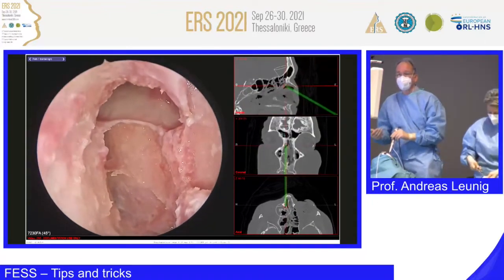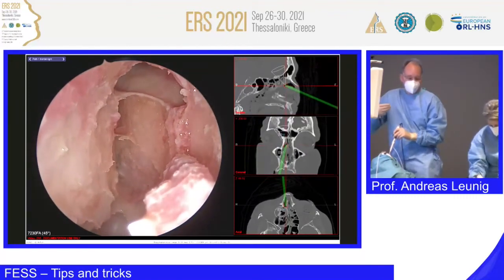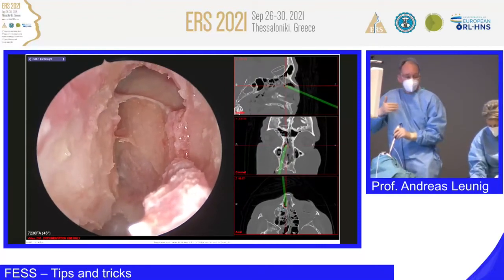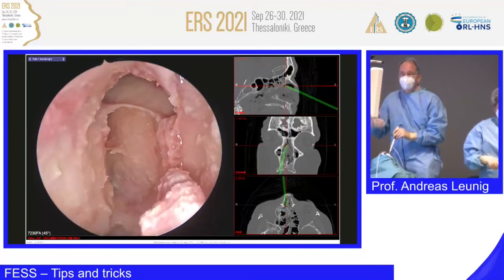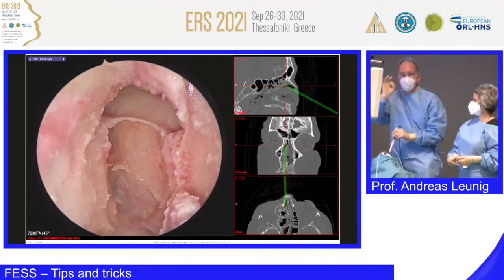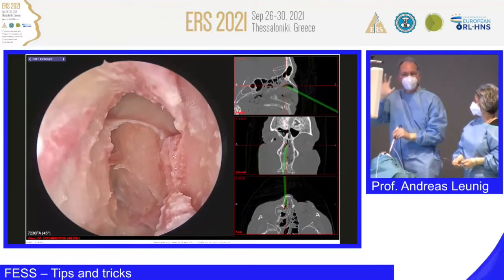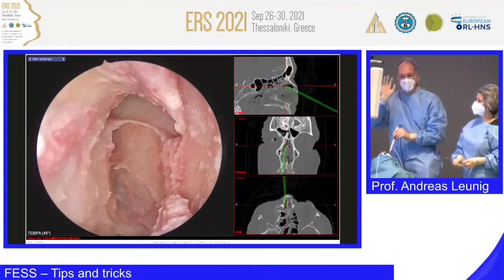Usually these are cases that are referred to me. Then you have to try. You have to come again, maybe drill again, and then you will see if a stent makes sense. But my experience is that the Propel stent doesn't make sense when you have denuded bone. So a wide exposure is the best way to prevent it when you do this kind of traumatic surgery. This is really rescue surgery, limited to single cases.